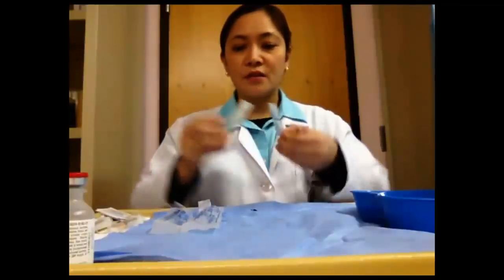Okay, so now we are going to prepare medications from a vial and from an ampule. Of course, we have to do thorough hand washing before preparing your equipment, which I have done already. So the equipment that we're going to use are syringes with needles attached, and extra needles for injection.